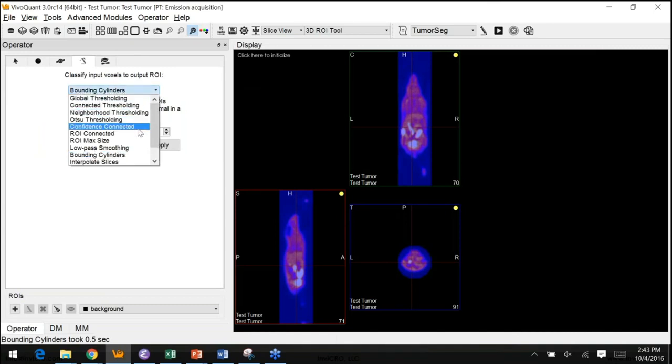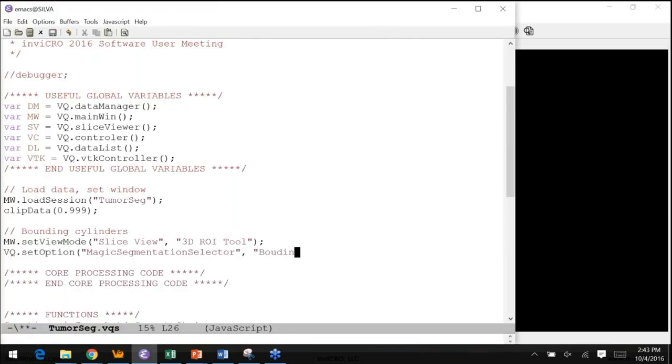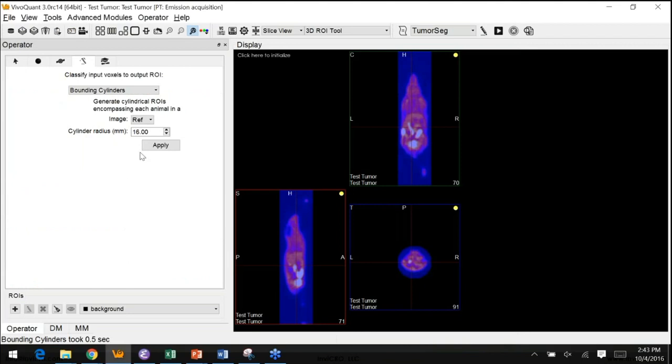In the past, you had to select the index into it, which is, if we have some drop-downs, in some places have different indices depending on if you have certain license configurations, and if we added stuff, things kind of change position. So it's a little nicer to call them by name. Selector. And it's good practice to set all of the parameters in case someone had them set to a different parameter beforehand. So go ahead and do that.